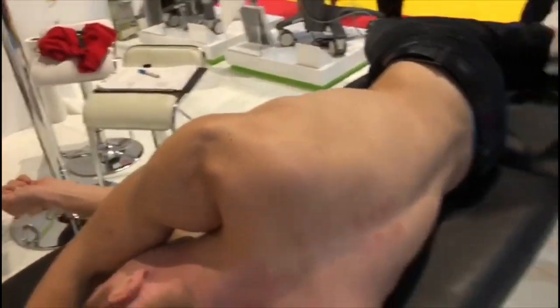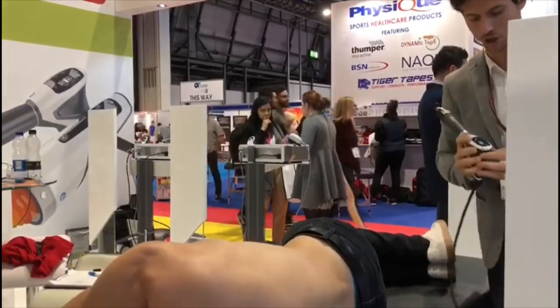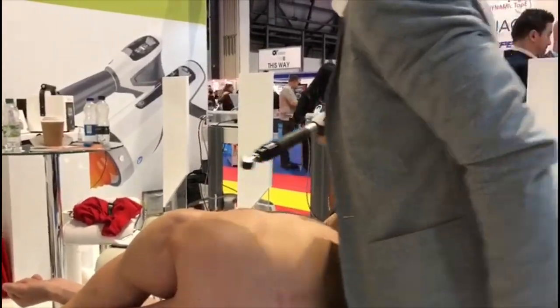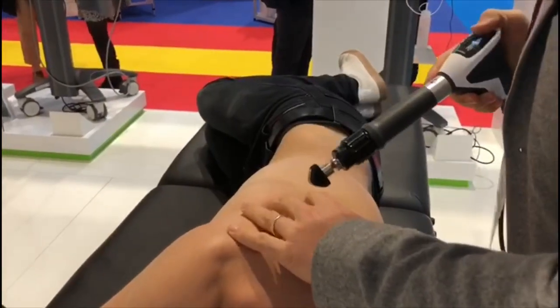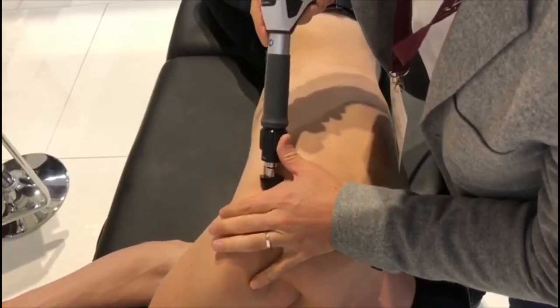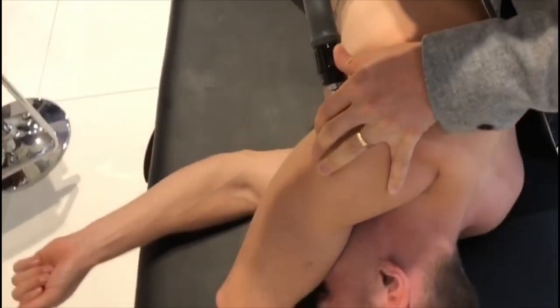This can be a bit painful, but it should be bearable for you. So let me know if you think I should increase or decrease the energy. So I'll put the hertz up to 10 now. And I won't use any gel, so it will be a bit sticky against the skin. Just so you know, right? Feels alright? Yeah, fine. Okay.